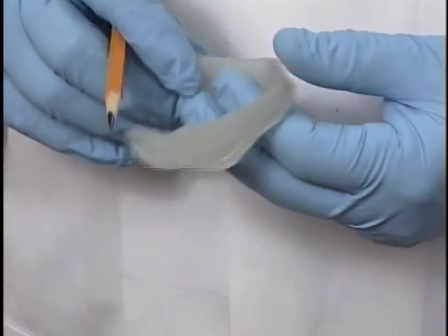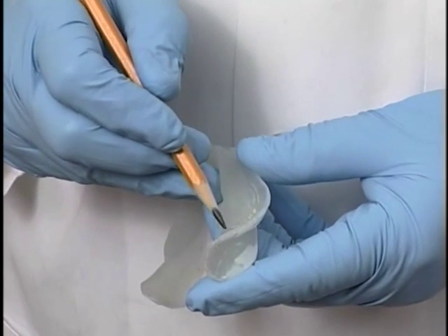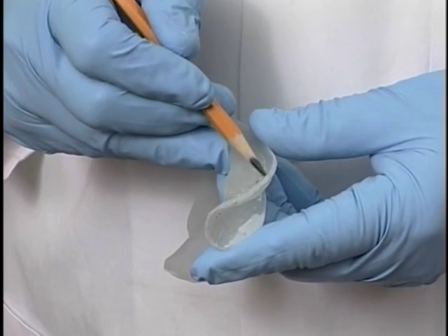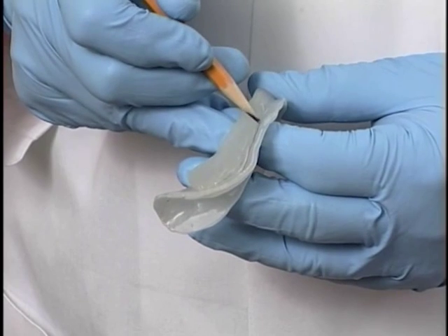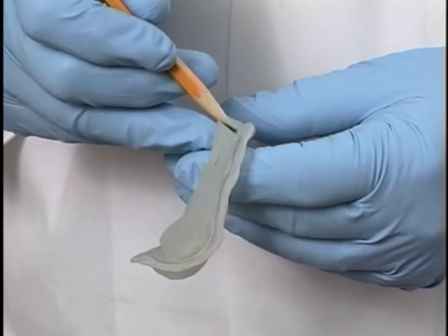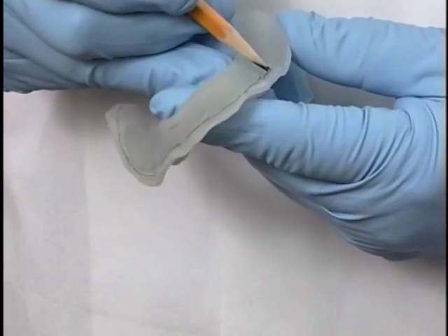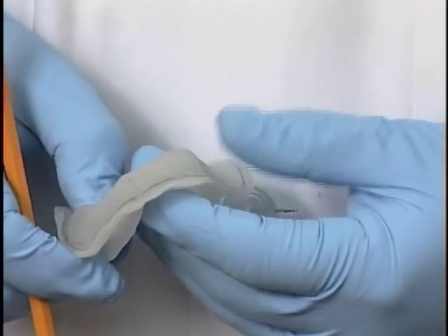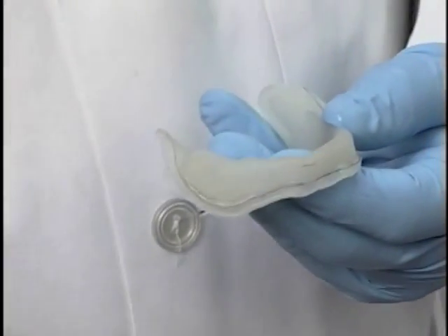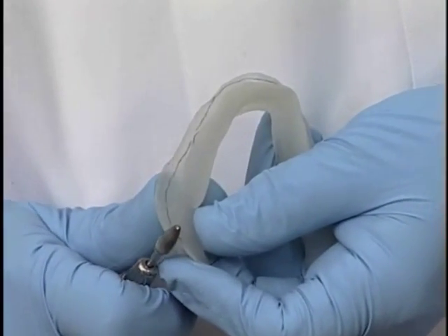We were going to mark onto this tray the areas that need to be reduced. And we found that basically all of the facial peripheries were overextended in that they interfered with the movement of the lips and the cheeks. And so we're going to shorten those down about 2 to 3 millimeters all the way around. Once we've marked them, then we're going to take a slow speed handpiece, and we're going to trim these peripheries.